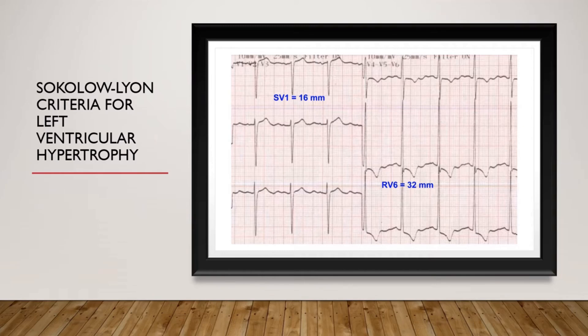In addition, you can see ST depression in V5 and V6, along with T wave inversion in V4, V5, and V6. These are features of left ventricular hypertrophy.